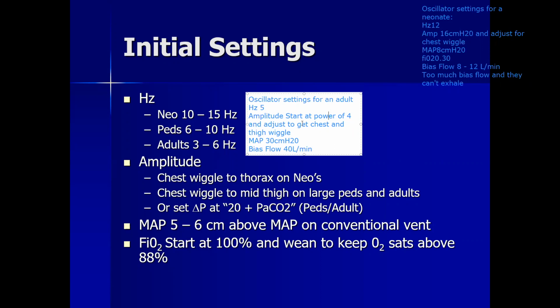What is an average amplitude? No, I would be making up a number. I don't have anything written down for amplitude for the adults. So you just keep adjusting it until you get a wiggle in the chest and thigh.